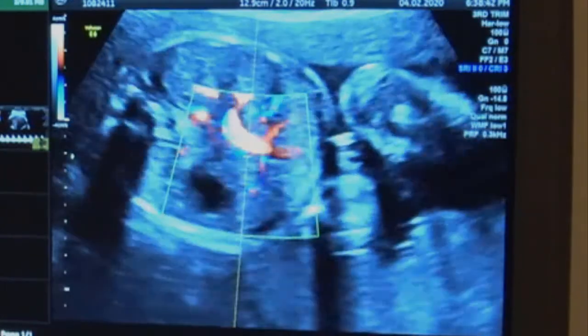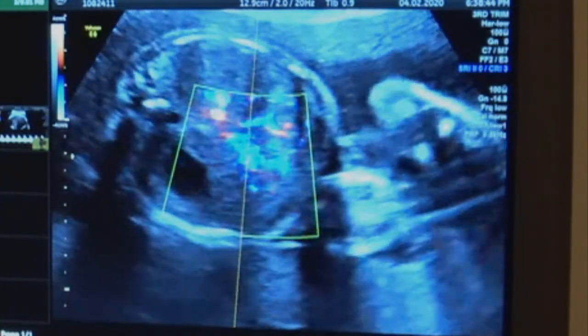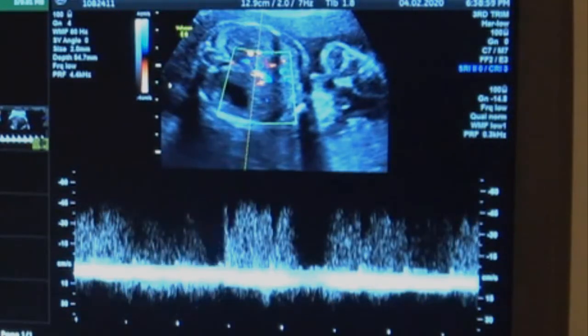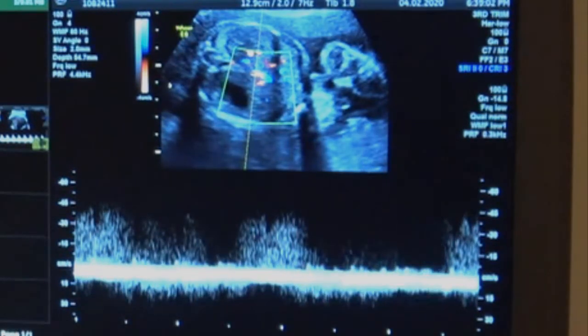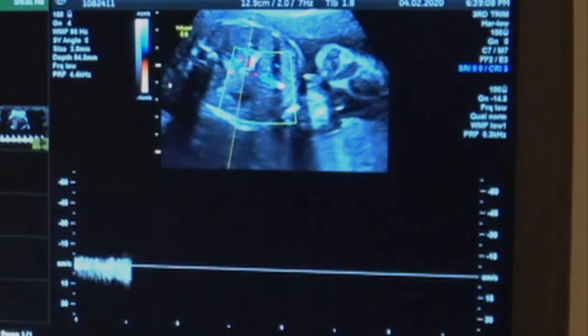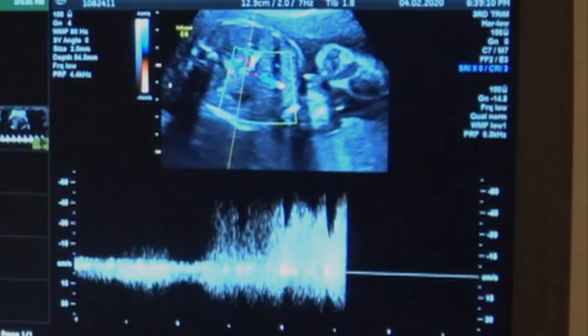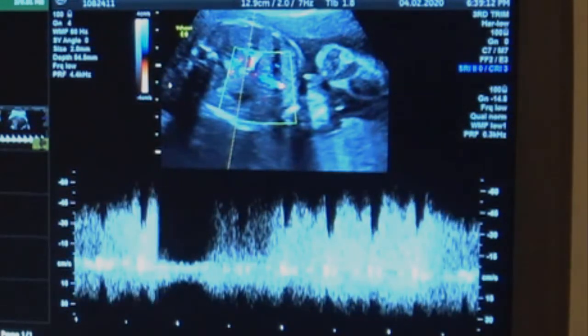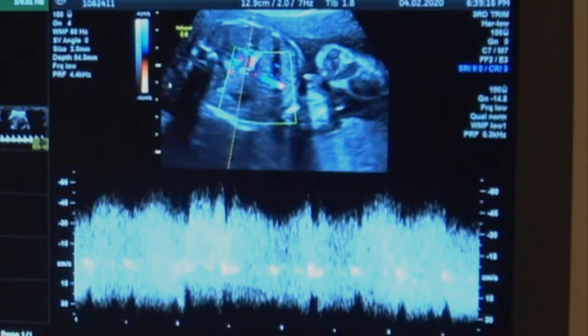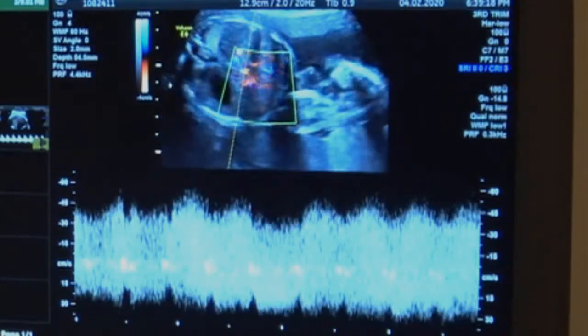And then it's a very tricky little vessel. The ductus has a really unique sound to it, you can't hear it very well, but you know when you're on it. Like I'm getting a bit of noise from contamination from the other little vessel there.